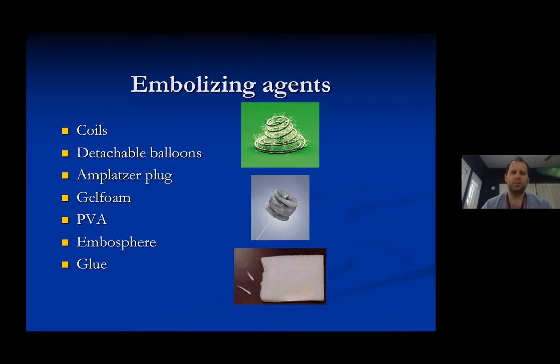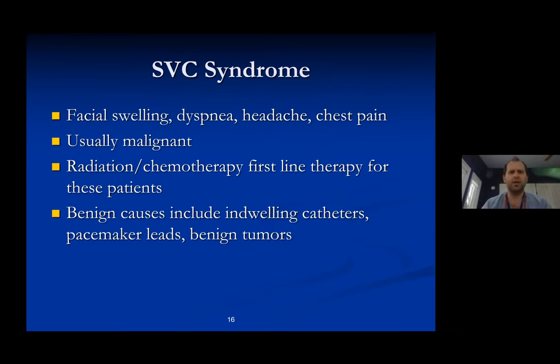So, we have a range of embolics that include something that you can inject, so something that can be emulsified into a particle, to devices that are more complex structurally, that are essentially permanent occlusives, such as these plugs. The mainstay of embolization really are these little coils. And coils come in 1,000 different flavors, maybe not 1,000, but certainly a few dozen. But certainly those are the mainstay of embolization worldwide, essentially.